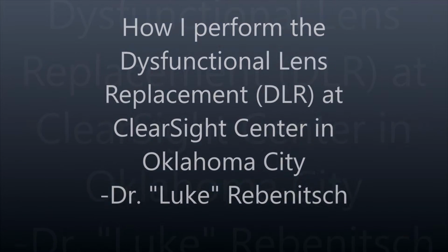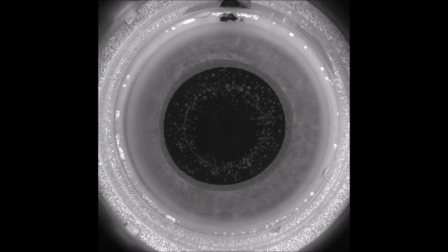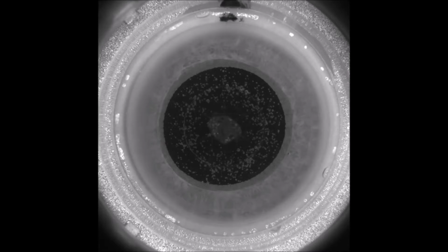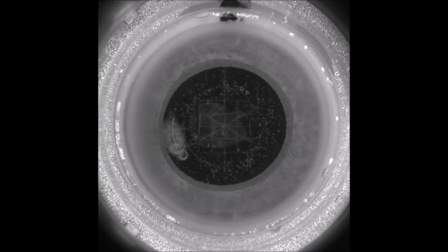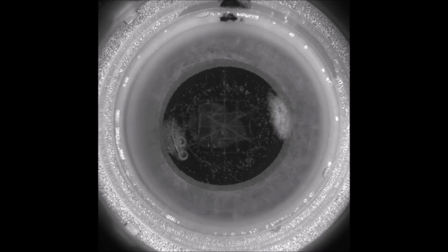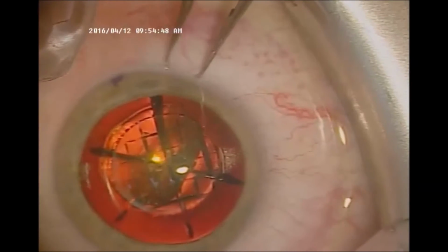This is how I perform the DLR. So first we start by using the femtosecond laser to create the capsulotomy, followed by the fragmentation of the crystalline lens. Now, after the fragmentation, we correct the astigmatism, and we move on to the operating room.